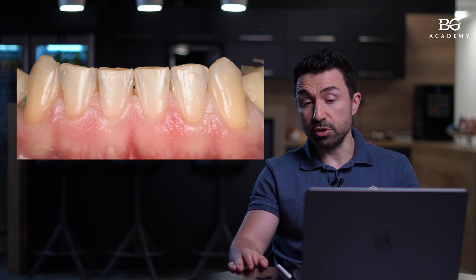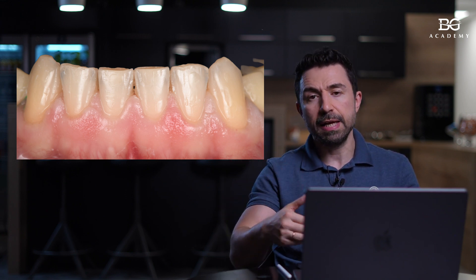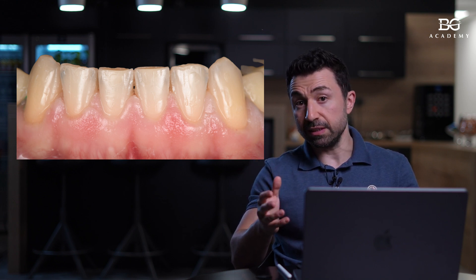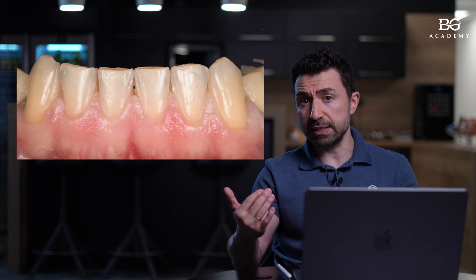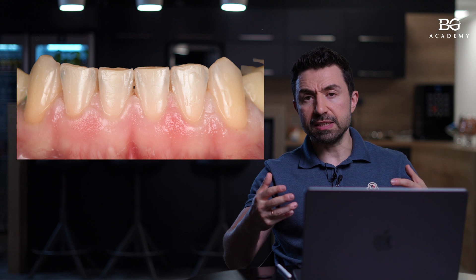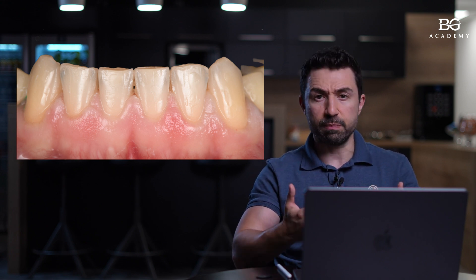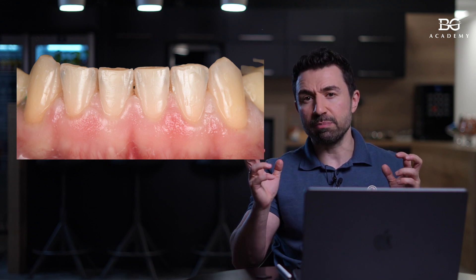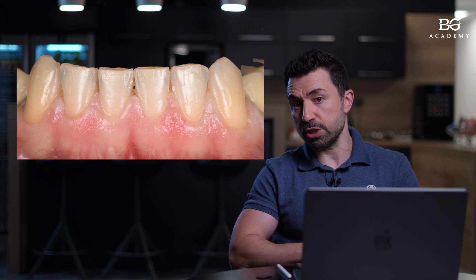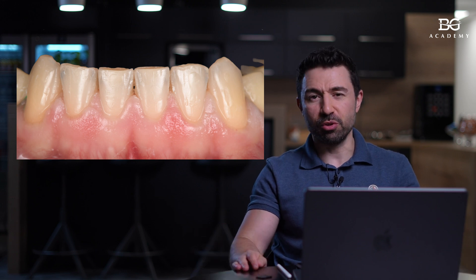Let's do this kind of reduction in a predictable way, because we have multiple options when a patient has protrusion or rotation and your dental technician makes equilibration of the teeth digitally when making the digital wax-up. He brings the teeth into the aesthetic curve, does the wax-up, and gives it to you. You will have to pre-cut the patient's teeth — these extended parts — to do the mock-up and go for the preparation. We can use multiple options, such as just prepping as you want, which may not be predictable enough.